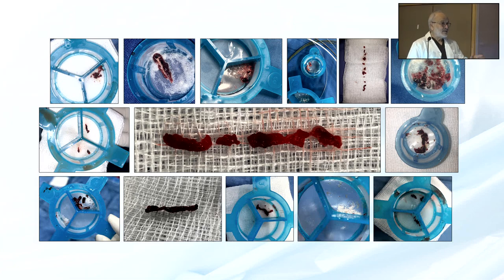I think at a senior level, this is worth thinking about, and it has to be learned properly for at least 2 or 3 cases under a senior person, and only then you try, because there are so many intricacies involved. Distally you don't see anything, so you go clockwise slowly, and if you have resistance, you sometimes deflate the balloon, put it further, again inflate it at a little low pressure, and try to enter. Once you start doing it, you will start learning those intricacies.